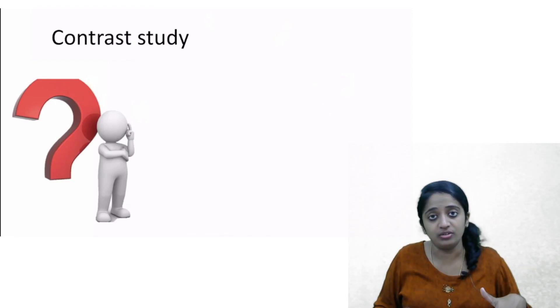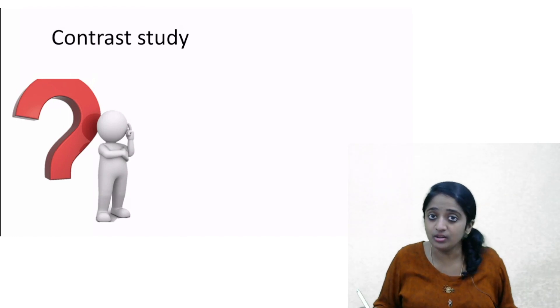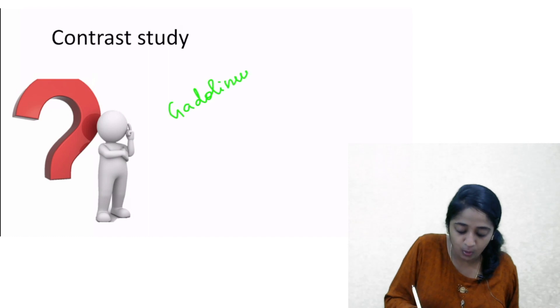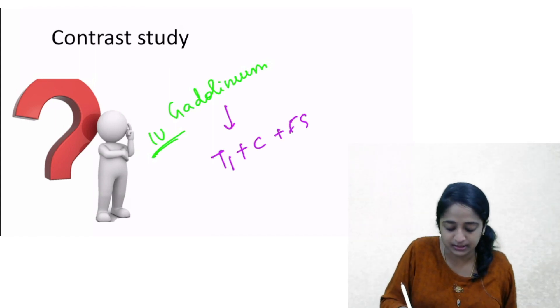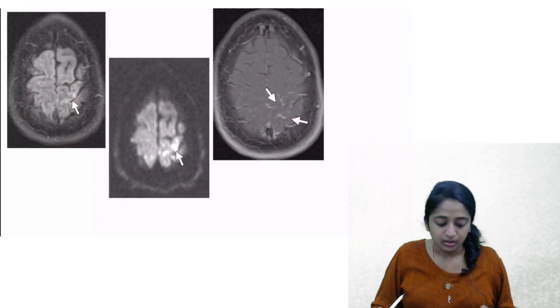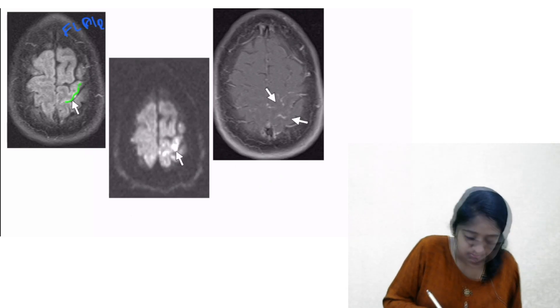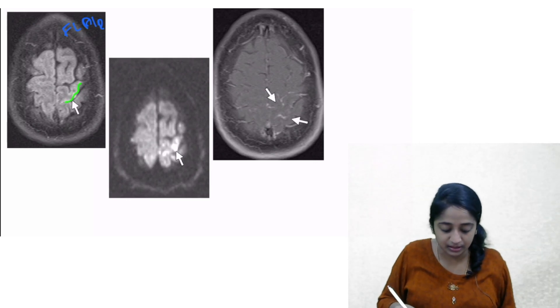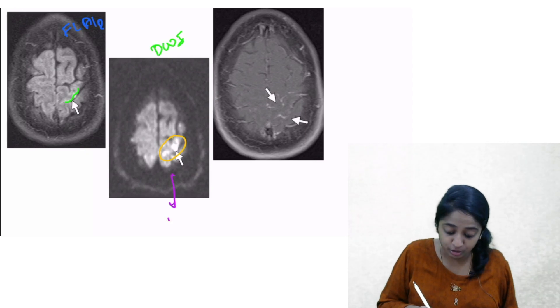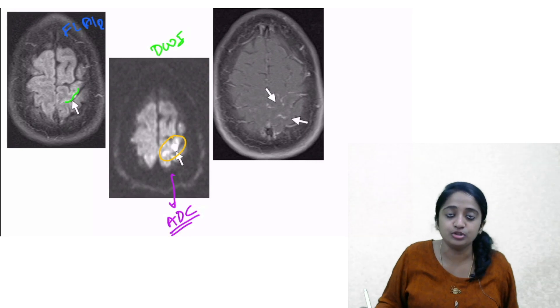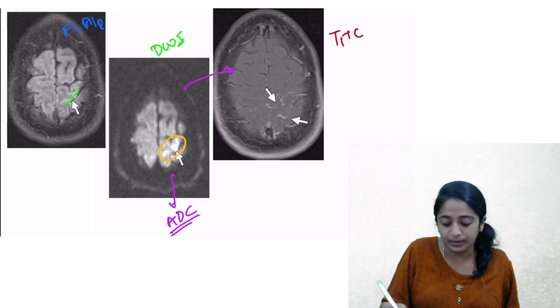Now let's consider what you get in the post-contrast sequence in a patient diagnosed with acute infarct. The contrast is given intravenously, and the image obtained is a post-contrast T1-weighted sequence with fat suppression. Here are three images: on the left is the FLAIR sequence — I see subtle hyperintensity. In the middle is the diffusion-weighted image — I see bright hyperintensity, confirmed as true diffusion restriction on ADC. And on the right is the post-contrast T1-weighted image with fat suppression.